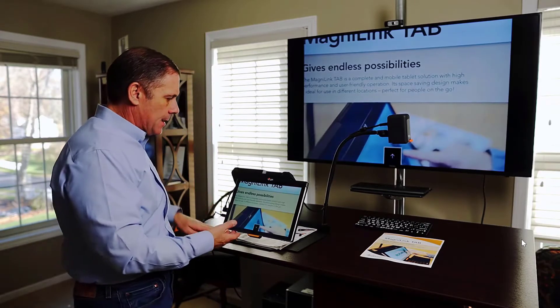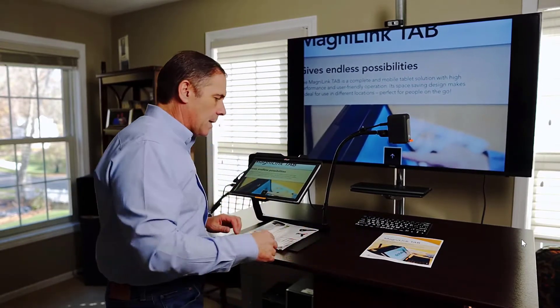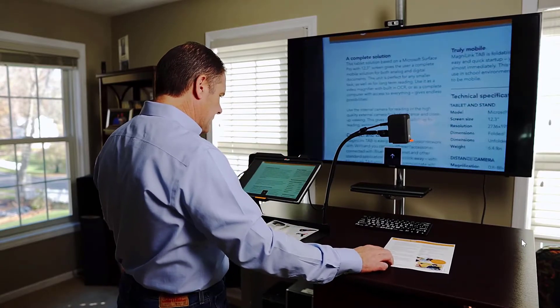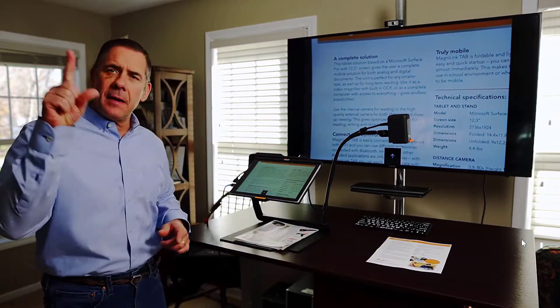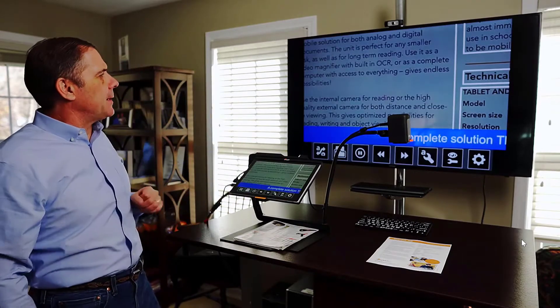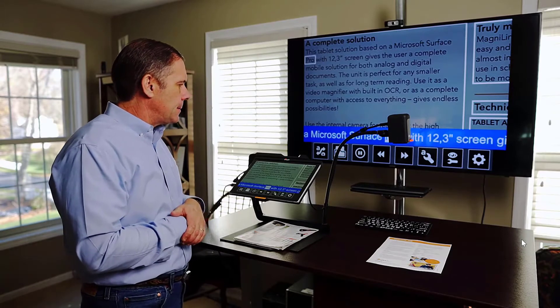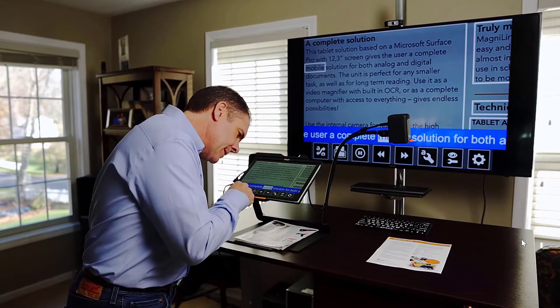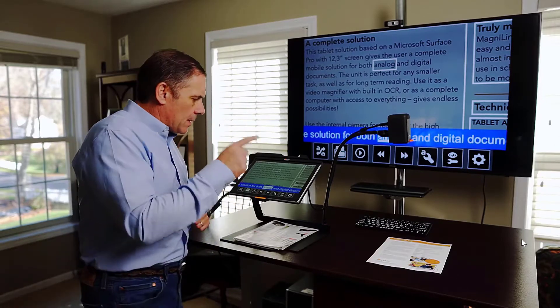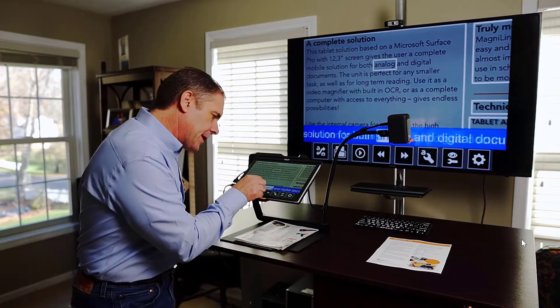To get back to full screen, five fingers on — and I'm back. Now I want to take it to another level and do some OCR. I'll turn this camera and just grab a little of this by pressing my finger on the screen and removing it — it is now scanned. Based on a Microsoft Surface Pro with a 12-inch screen, this gives the user a complete mobile solution. I can now manipulate this to follow along and magnify the print.